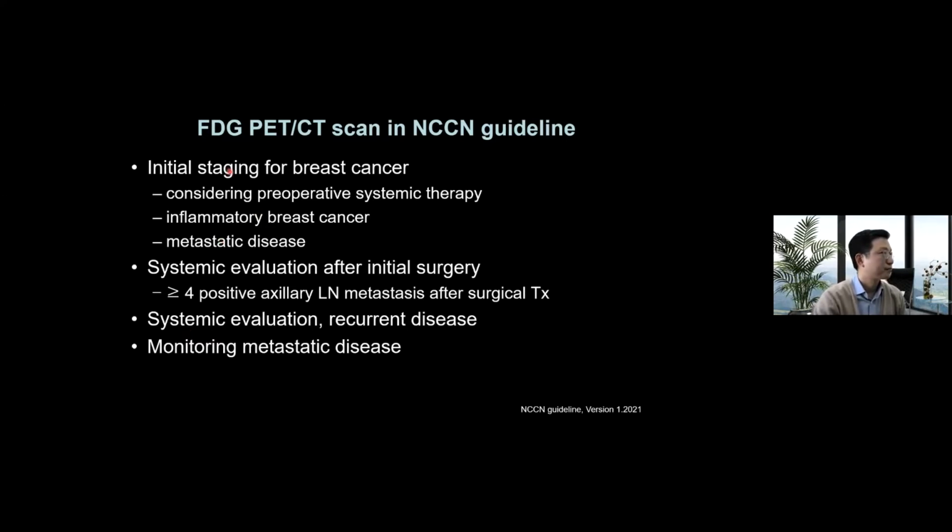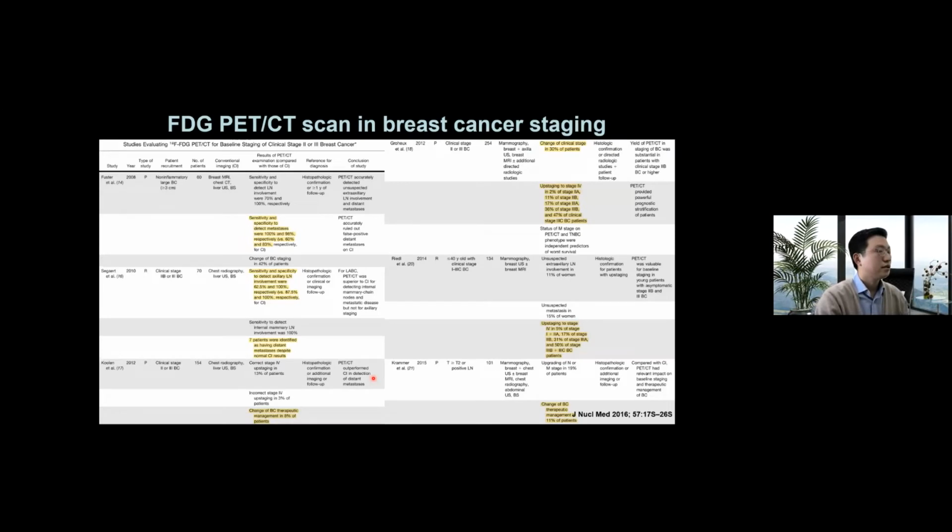Otherwise, FDG PET was not recommended because there is not enough evidence to support. So this is a relatively recent review paper from JNM in 2016 to show FDG PET scan in baseline staging.